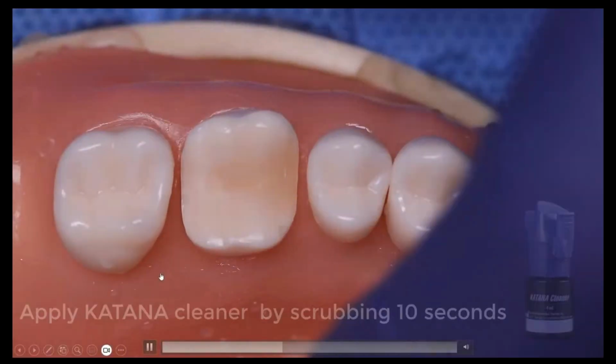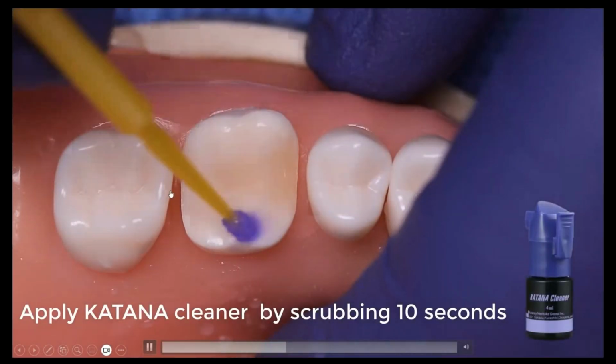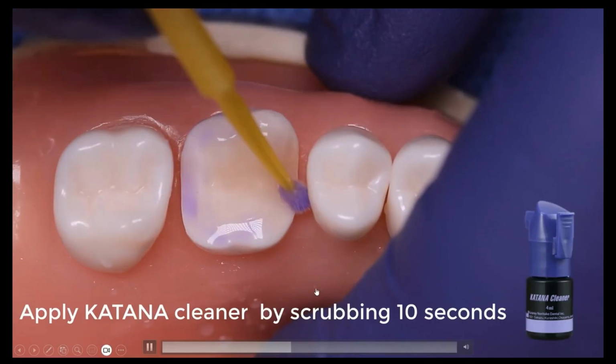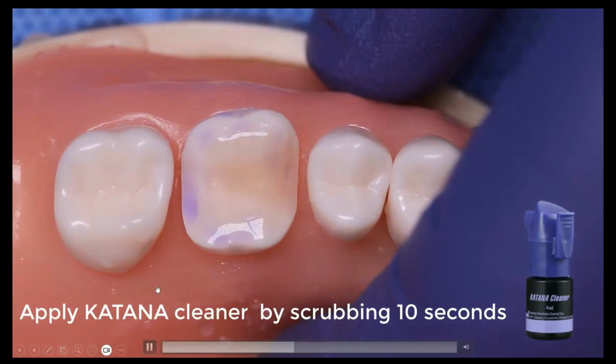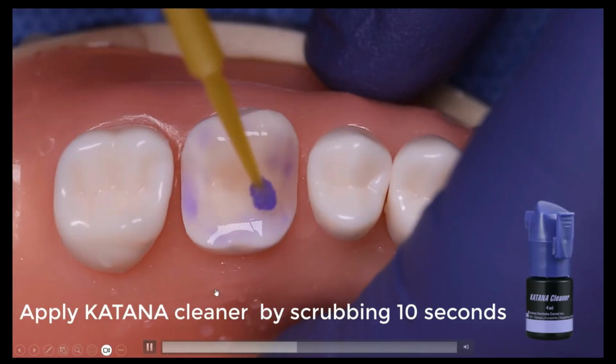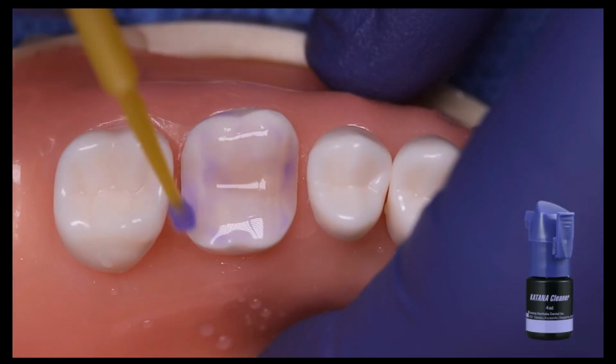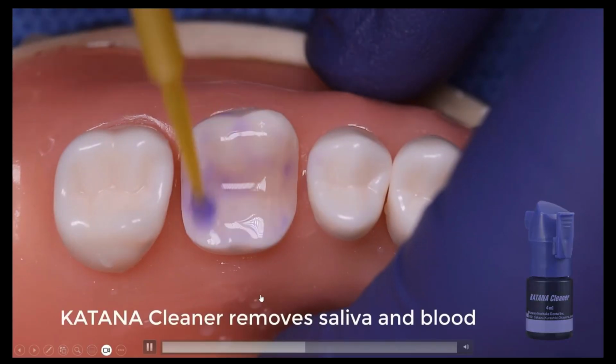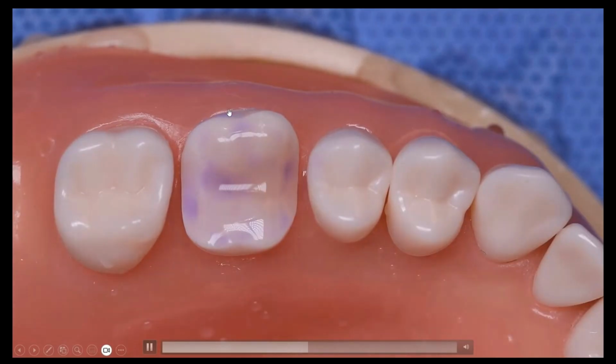Now, you're going to make your temporary how you normally do. So temporary already made. I've got my occlusion adjusted. Now I'm using Katana cleaner. I love this product to remove temporary excess cement, and I just love using it underneath my directs and my indirects. So you apply it for 5 to 10 seconds, roughly 10 seconds, and you gently rinse it off. This removes all the blood and saliva.